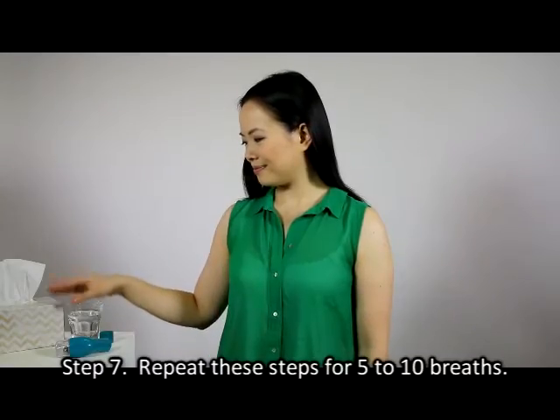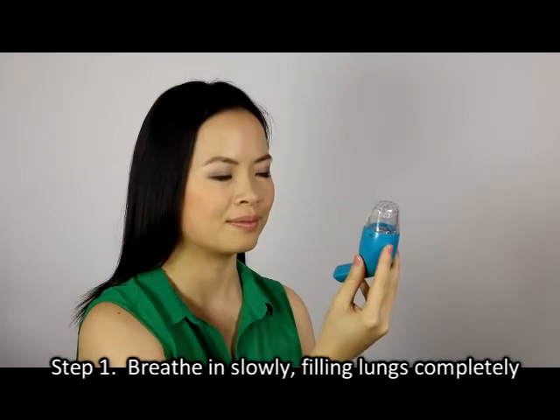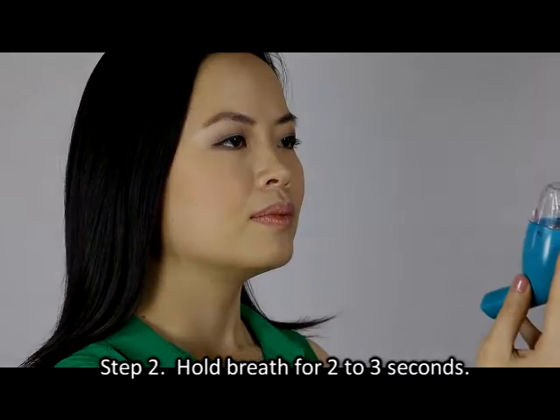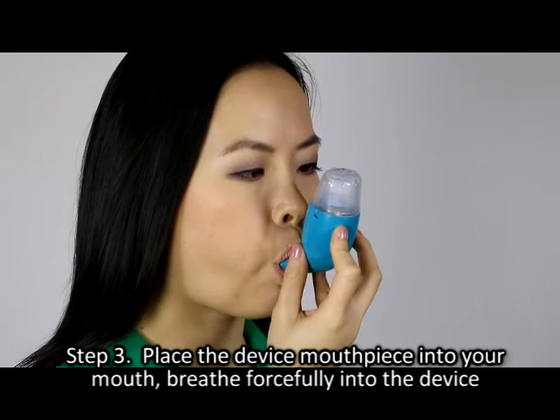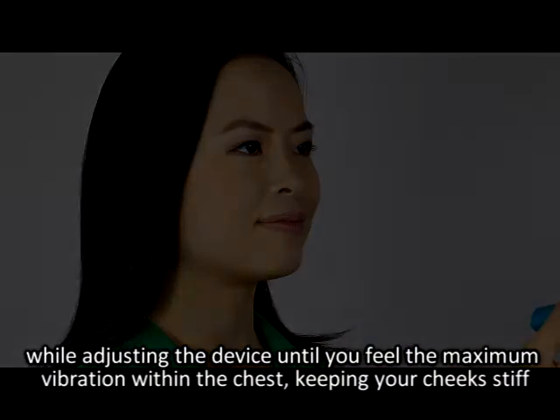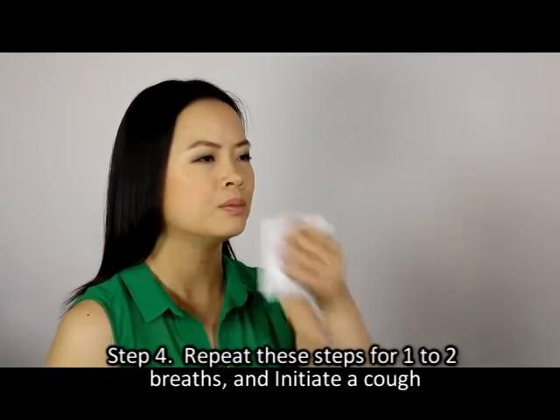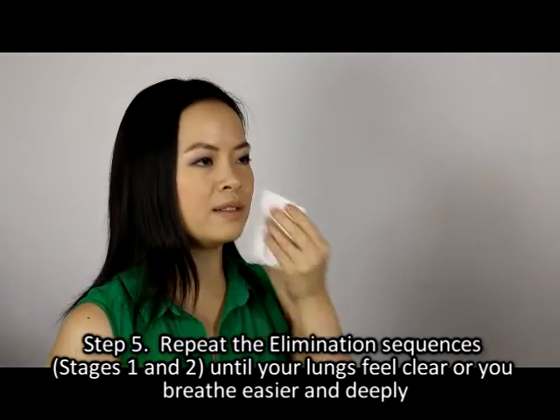Step six: attempt to suppress any coughing. Step seven: repeat these steps for five to ten breaths. Stage two — mucus elimination process. Step one: breathe in slowly, filling lungs completely. Step two: hold breath for two to three seconds. Step three: place the device mouthpiece into your mouth, breathe forcefully into the device while adjusting until you feel the maximum vibration within the chest, keeping your cheeks stiff. Step four: repeat for one to two breaths and initiate a cough.